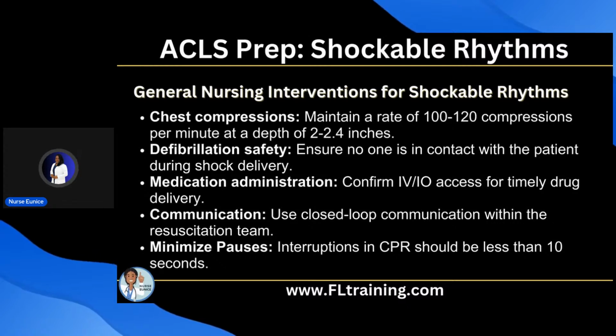So ensure no one is in contact with the patient during shock delivery, but that immediately once the shock has been given, we go right back into those high quality chest compressions.